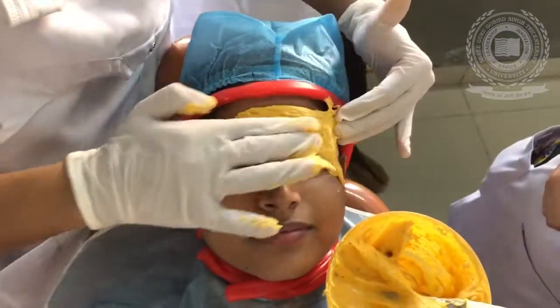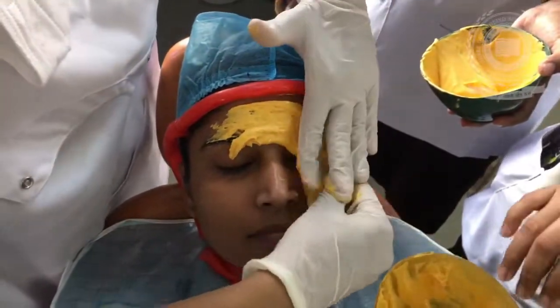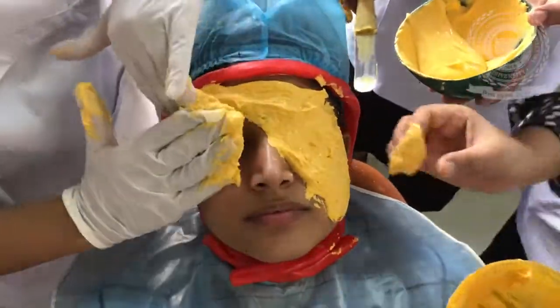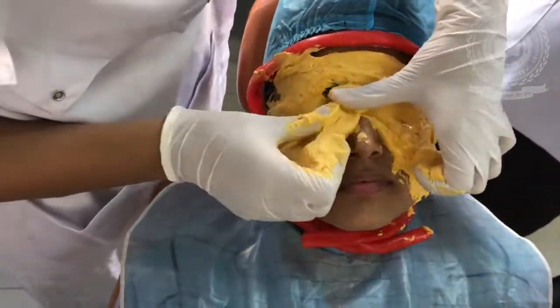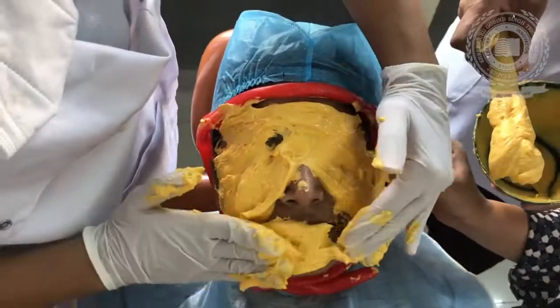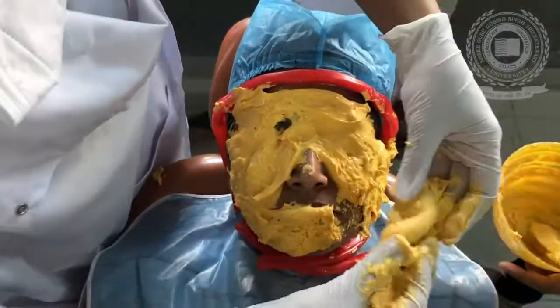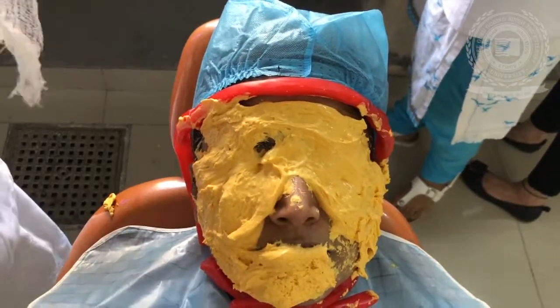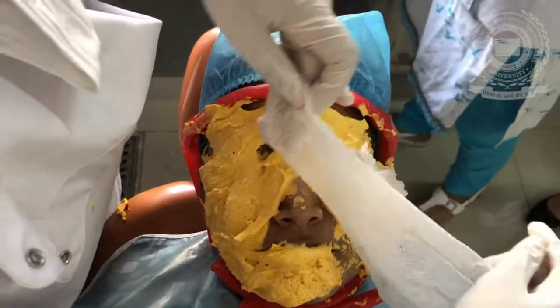We will cover it properly so that no area is left. We will do it quickly. We will cover it with a gauze piece, and the gauze piece should be wet.